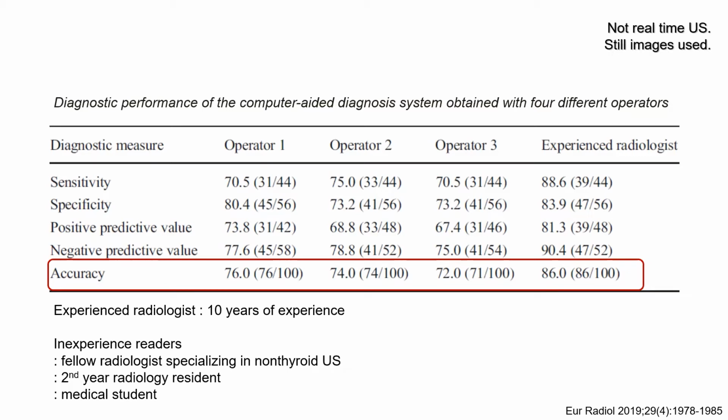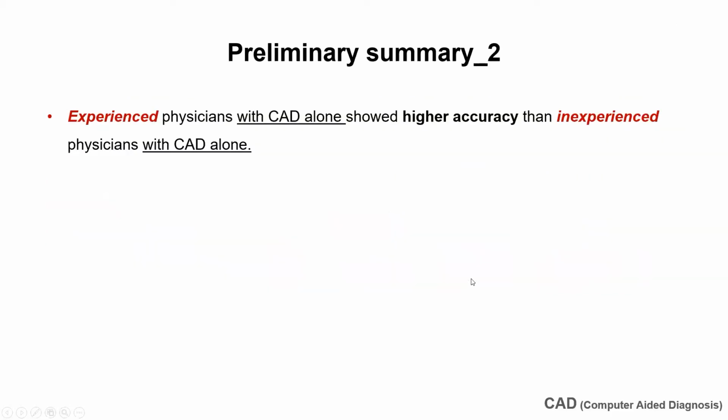As these differences result from the choices ultrasound performers make, the diagnosis of CAD alone is consequently more accurate in experienced readers compared to inexperienced readers. In short, experienced physicians with CAD alone showed higher accuracy than inexperienced physicians with CAD alone.